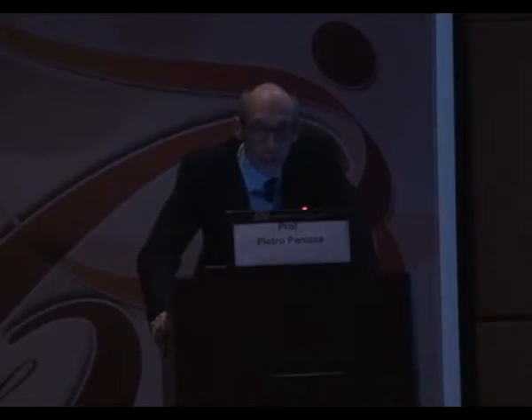Category 1, no disease. So it depends on the indication of the examination. We can continue with the routine screening. The same with benign findings. With category 3, it means probably benign. We'll talk about it. Suspicion of abnormality, category 4.